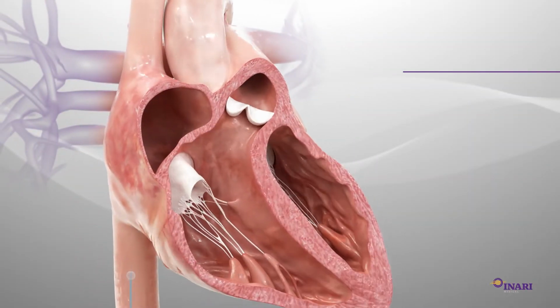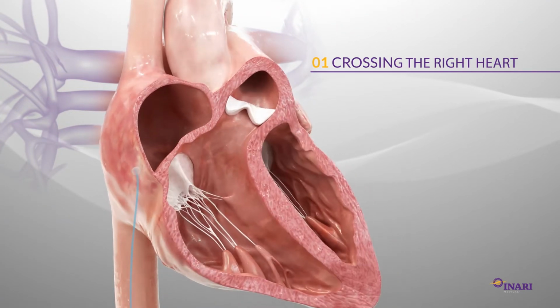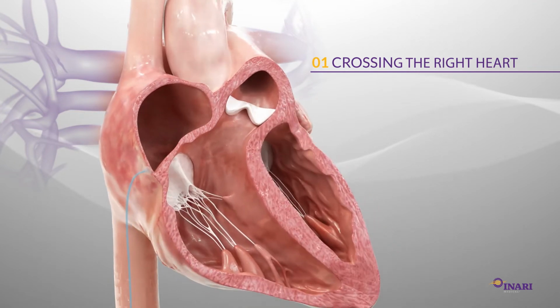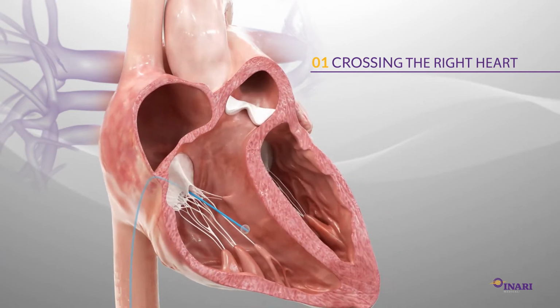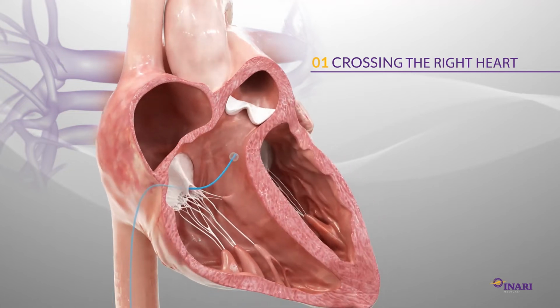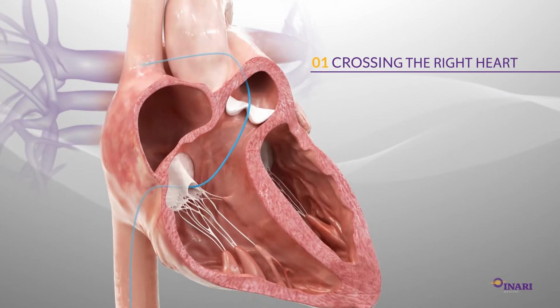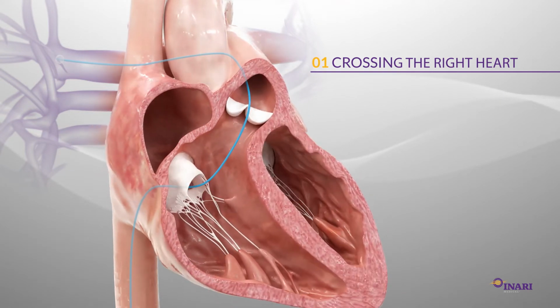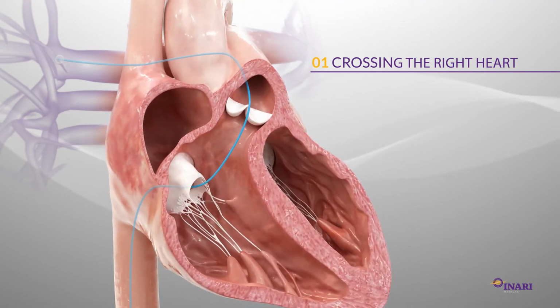The catheter should be advanced to the right atrium, then rotated until it points towards the right of the screen. Advancement at that point usually directs the catheter down through the tricuspid valve. Once the catheter reaches the right ventricle, a quarter to half turn clockwise will direct the balloon tip upward towards the right ventricular outflow tract, RVOT. Advancement of the catheter, timed with favorable catheter orientation, should facilitate passage through the pulmonic valve into the main pulmonary artery.